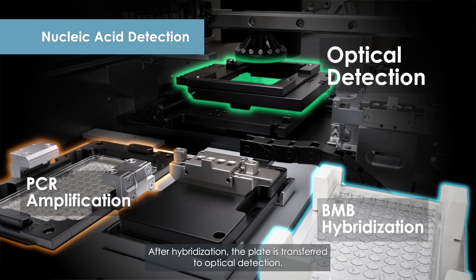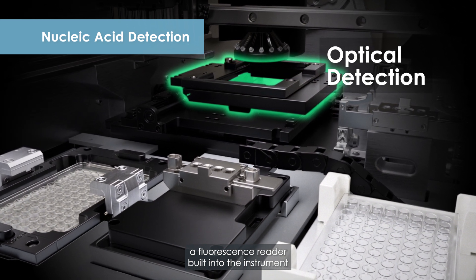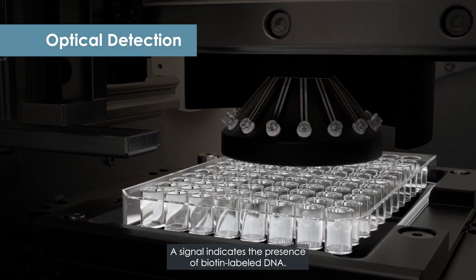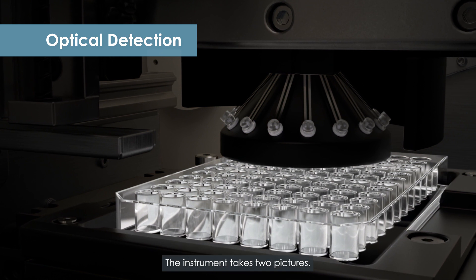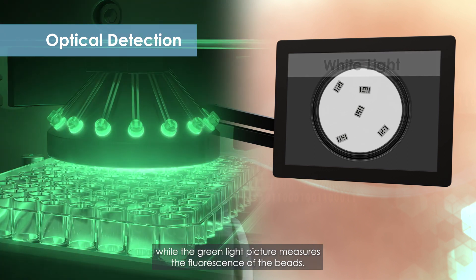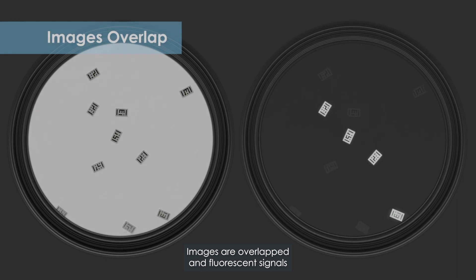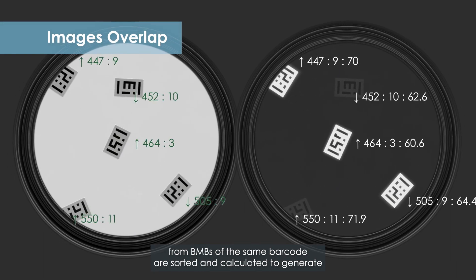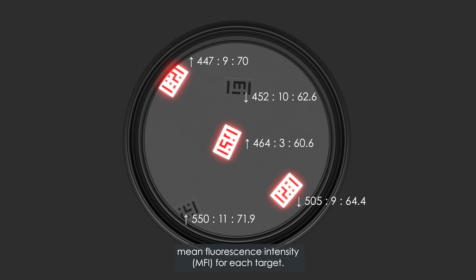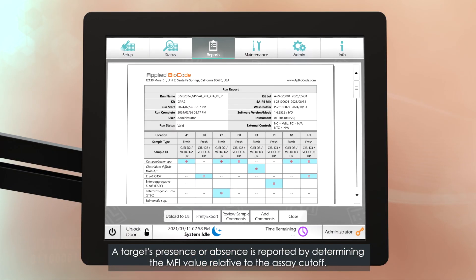After hybridization, the plate is transferred to optical detection. A fluorescence reader built into the instrument detects the fluorescence signal emitted by the SAPE. A signal indicates the presence of biotin-labeled DNA. The instrument takes two pictures: the white light picture identifies the barcodes of the beads, while the green light picture measures the fluorescence of the beads. Images are overlapped, and fluorescent signals from BMBs of the same barcode are sorted and calculated to generate mean fluorescence intensity, MFI, for each target. A target's presence or absence is reported by determining the MFI value relative to the assay cutoff.